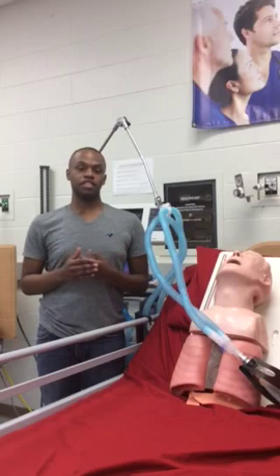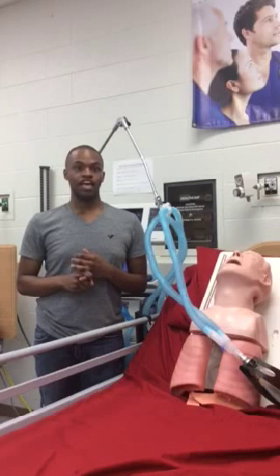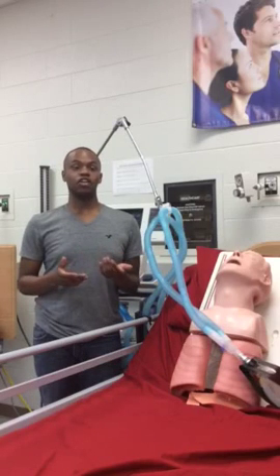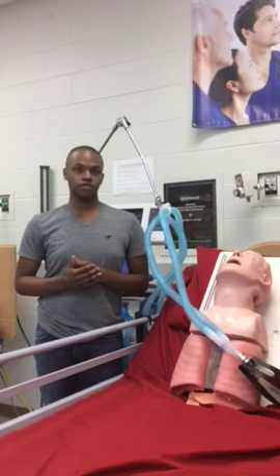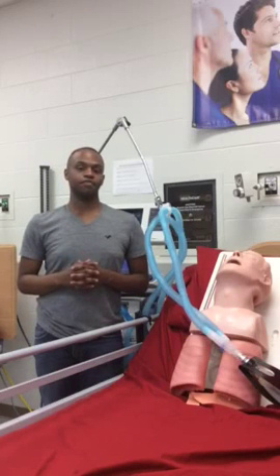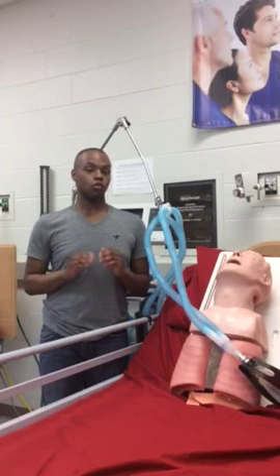There are other patient assessment skills I can use. I can look at her heart rate. Has it increased? Is she tachycardic? I can look at her blood pressure. Has it increased? Is she showing signs of cyanosis? Is my patient stable? Well, guess what? Miss Stevens is stable. So we're going to wean her.